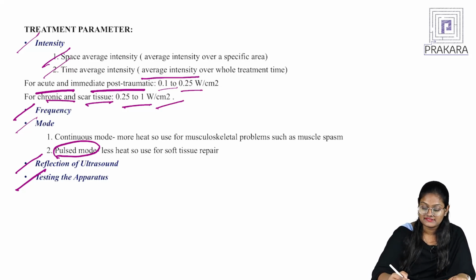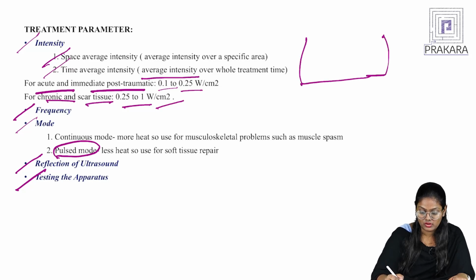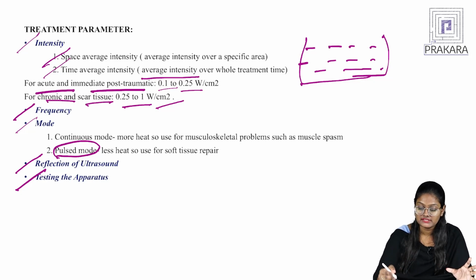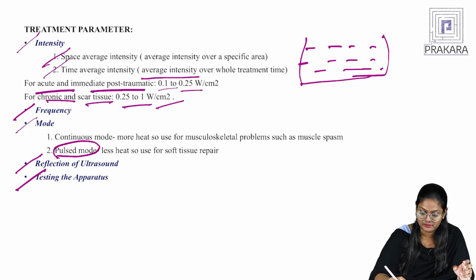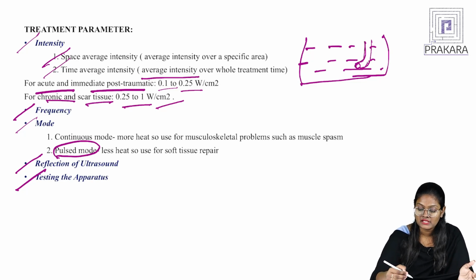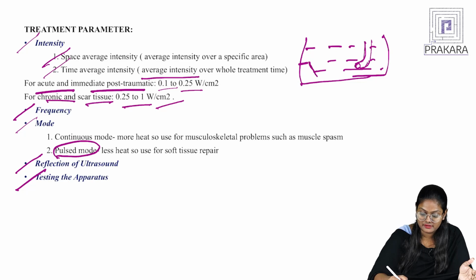Firstly, take a tub and fill it completely with water. Place the ultrasonic head into this tub or container. We have our head over here. Now, just take a metal plate.